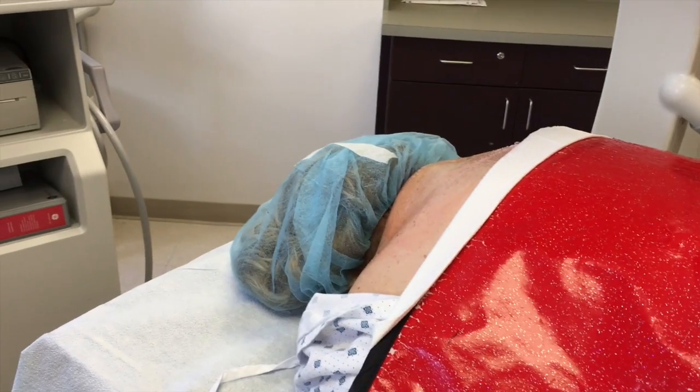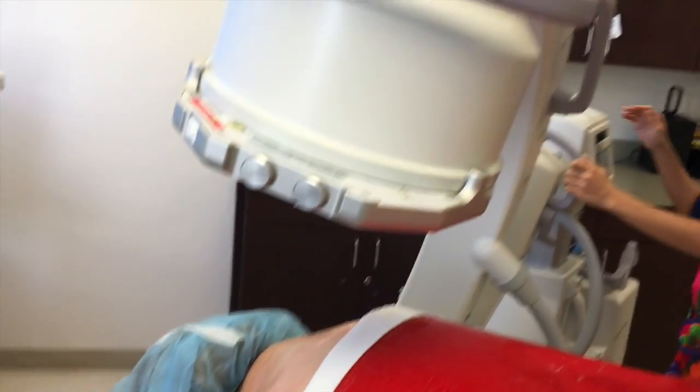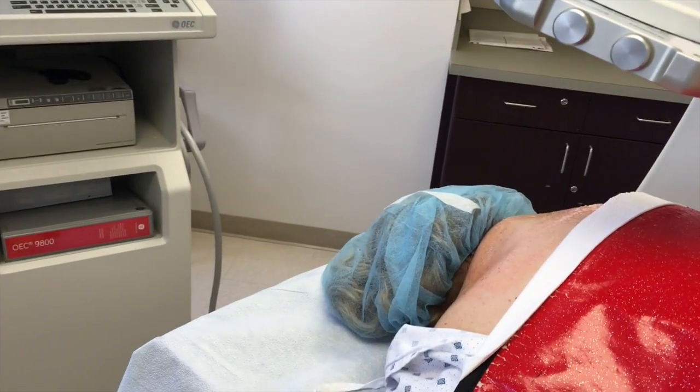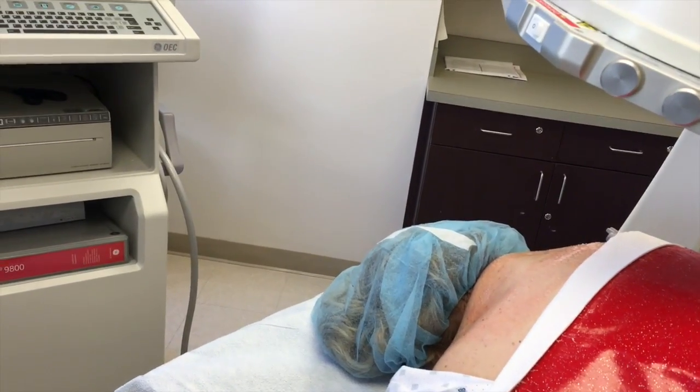Good morning and Happy Thanksgiving. Today I have requested a patient, Mrs. L, to allow us to do a cervical epidural in real time. She's an extremely pleasant lady on this eve of Thanksgiving. She's been kind enough to let us take a video and we're gonna see how she does. So here we are, we're getting ready. We have our C-arm and we're gonna proceed doing a bilateral cervical epidural.